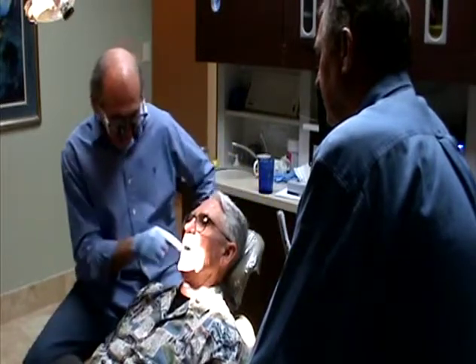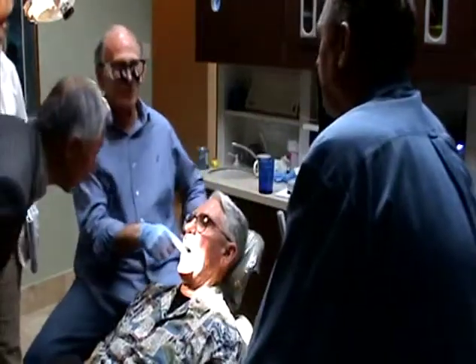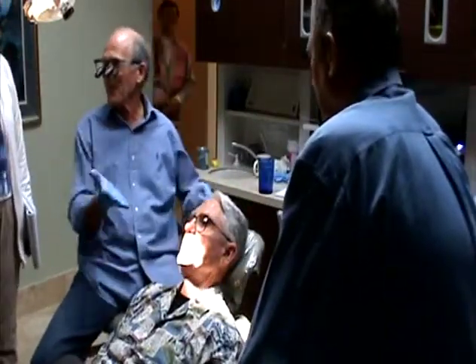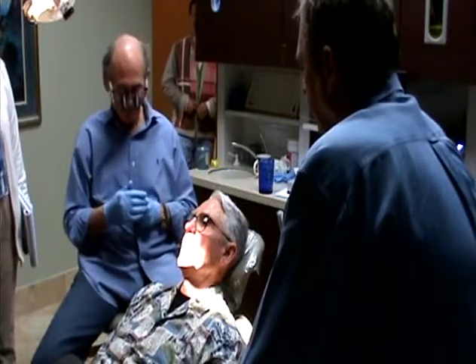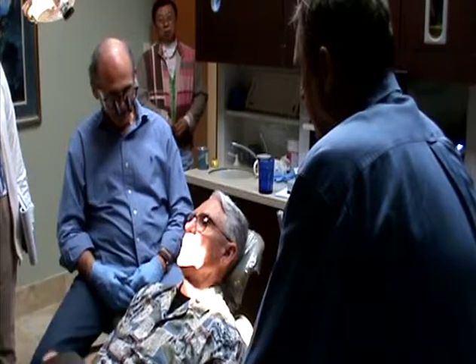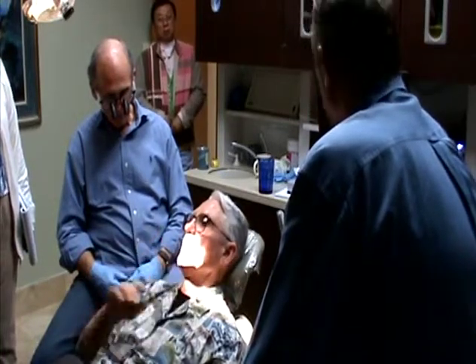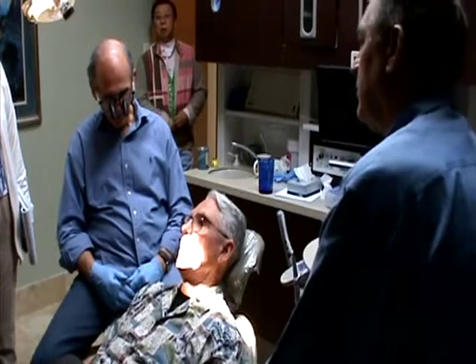And finally, the last place I touched was on the distal of the bicuspid, where he felt it. It showed up again originally. And now when I bite, it was really even. Well, that's good. Before, I could always pick up that one little spot. It's really even all the way around. Okay, so we can test you now. Yeah, test me again.